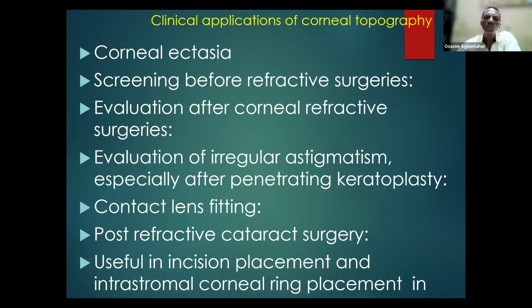It's actually a procedure involving corneal semicircle rings inserted inside the cornea to stretch it out, both superiorly and inferiorly. It generally depends on the kind of astigmatism you're trying to correct. Is it with the rule or against the rule?